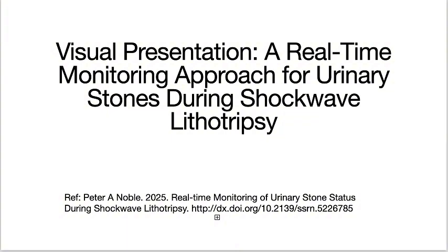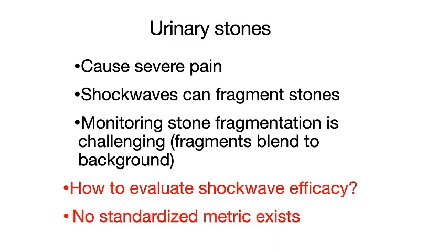Got it. Why should I be interested in urinary stones? Let me summarize. Urinary stones cause severe pain. Shockwaves fragment urinary stones. Monitoring the fragmentation is challenging as stone fragments blend into the background in X-ray images. Hence, how can we evaluate shockwave efficacy? No standardized metric exists.